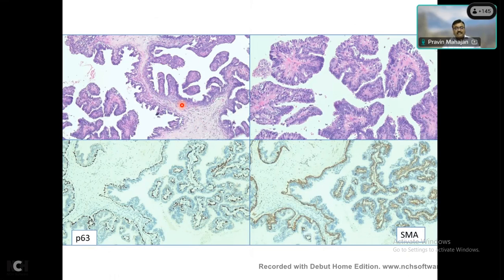If you see it is like a tree-like lesion, then one will say these are thick branches, and then there are small branches which are giving rise from the thick branch. That means it is like this thick fibrovascular core giving rise to small fibrovascular cores, on which you see this proliferation of cells, which are of two types actually. One is a luminal cell or ductal cell, and then the abluminal cell, which is a myoepithelial cell, which is towards the stroma of the core.